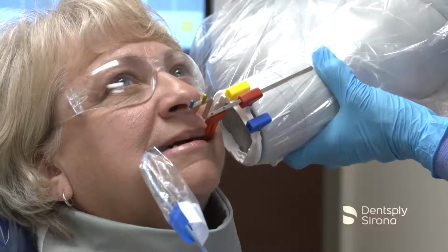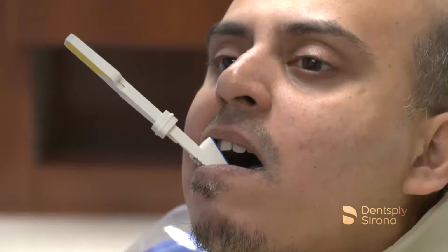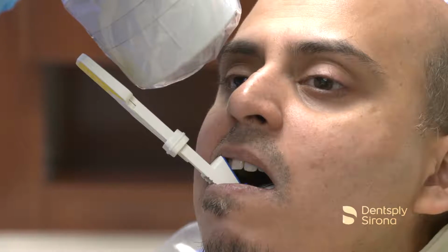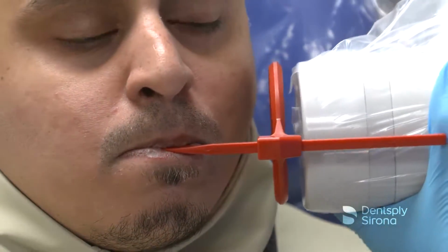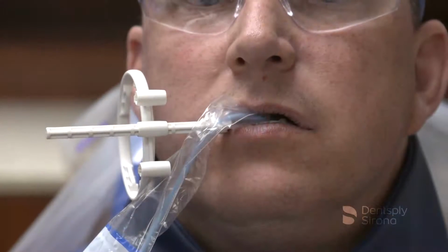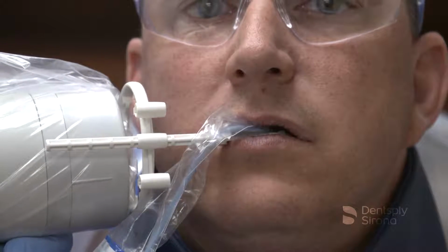This video is provided by Dentsply Sirona and is to be used as a guide to enhance the clinician's skill in acquiring quality radiographs. This informational guide is not intended as a replacement for the Directions for Use manual for any product shown. Always check your manufacturer's guidelines for recommended use of equipment.